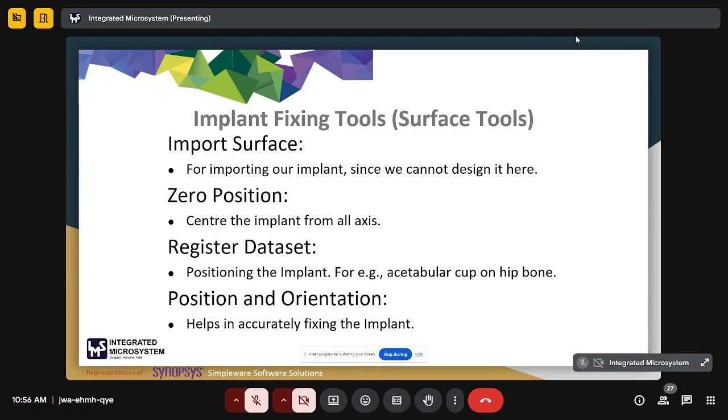This process is particularly useful when validating whether a particular implant design will accommodate individual anatomical variability or pathologies like deformities. Altogether, these tools play a vital role in implant position accuracy, design validation, and surgical rehearsals.